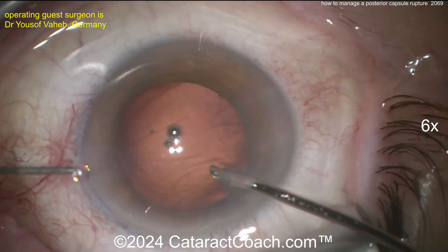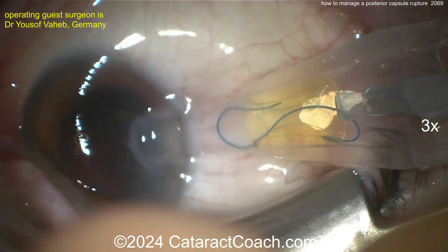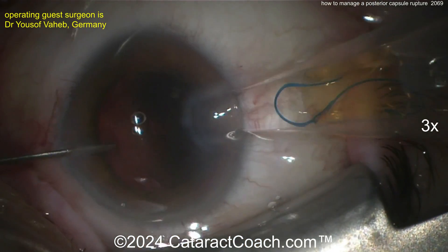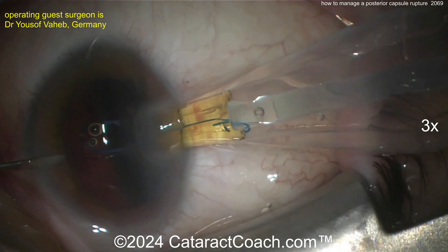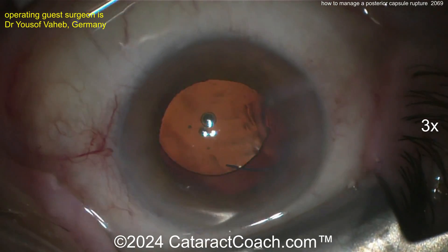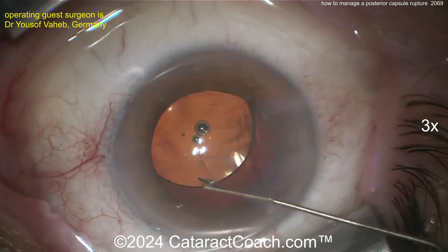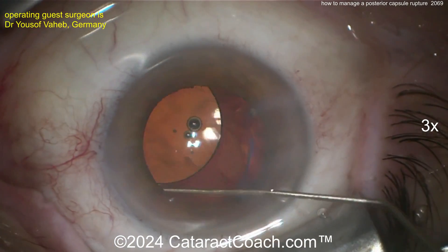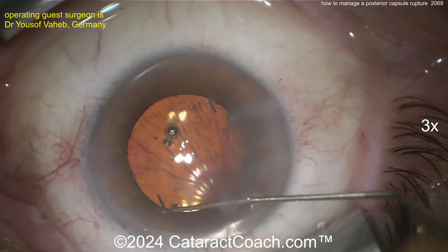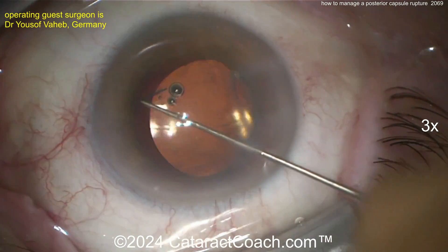You can already see the patient is going to have some corneal edema, some Descemet folds from all this extra manipulation. Now here comes a three-piece lens — placing the haptics in the sulcus, and maybe getting an optic capture as well. Remember when it goes in the eye: the leading haptic should come out like the number seven — the 'seven-L rule'. First haptic: number seven shape. Trailing haptic: capital letter L. Get those haptics carefully placed in the sulcus for good support.